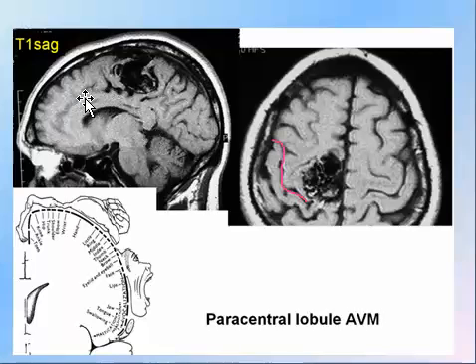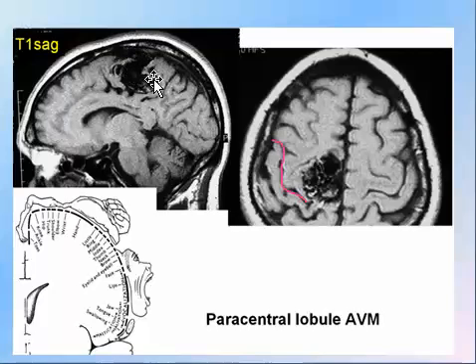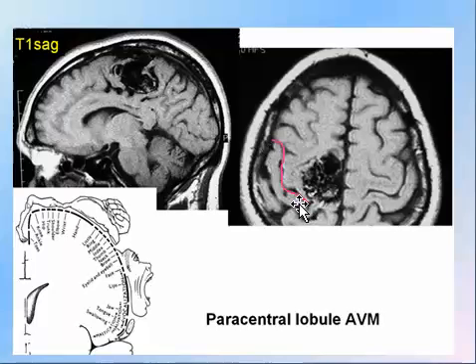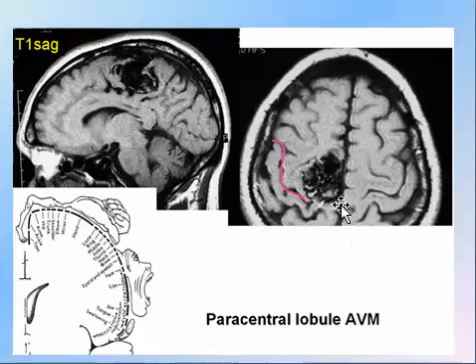In this area is the cingulate gyrus, the cingulate sulcus, and the central sulcus. An AVM is seen just anterior to the central sulcus near the midline, extending along the medial aspect of the brain hemispheres.